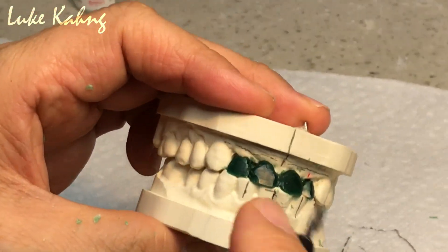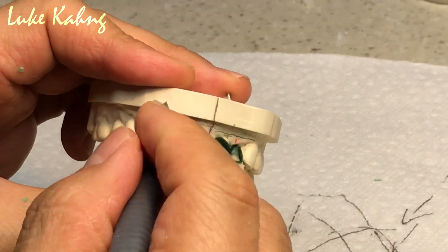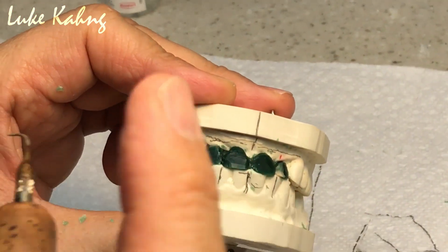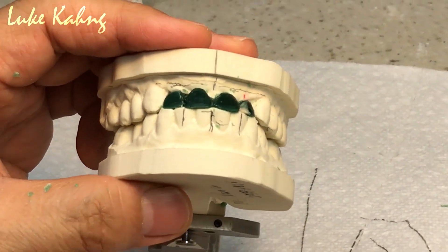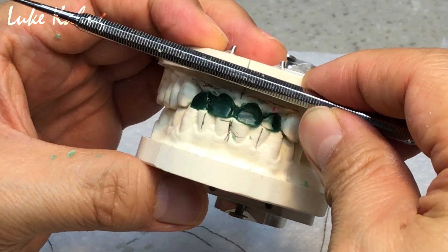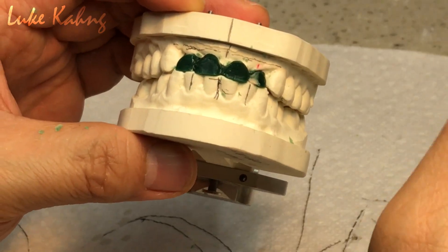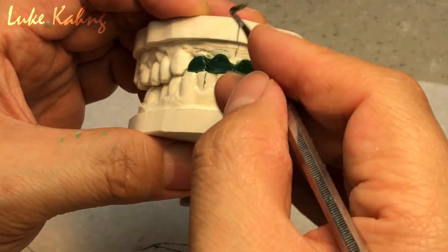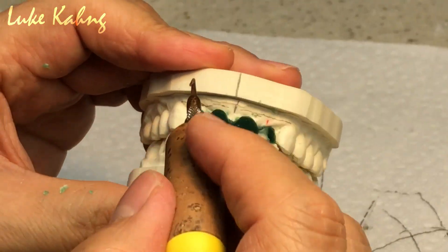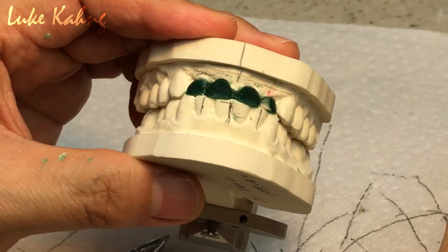Now here's a dilemma. You can add a little bit more because this is my final — just a tiny bit. It will be overlapping — why? This is controversy. Whenever they're smiling, some people don't like to show. But hygiene wise it's terrible, but cosmetic wise I have to add a little bit — just a little bit added for the aesthetic. Because this is the anterior, whenever they're smiling, I don't want to embarrass them.